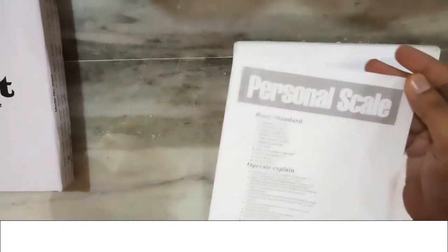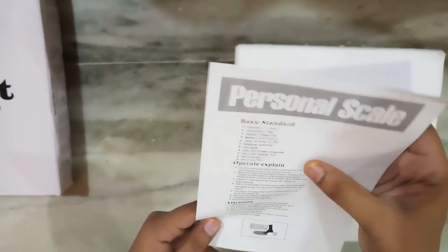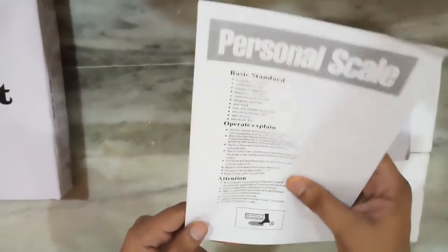So we have the personal scale manual. It has some of the standards, what all things are included in this and how to use it, and other things like warnings. I will keep this aside.